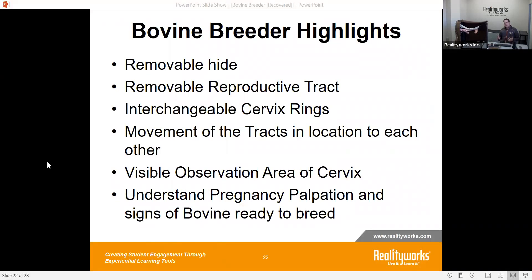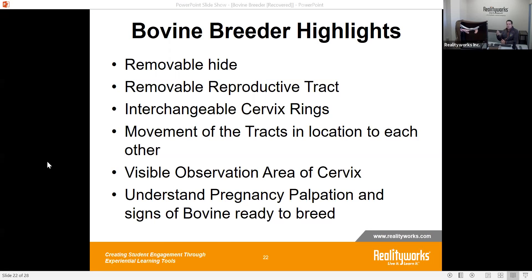Talking to Willie about the features the bovine breeder can provide for instructors: it gives you a removable hide and removable reproductive tract, the ability to take it out, let students work through and see the different parts of the tract, understand all the pieces of the reproductive tract, how artificial insemination works, how you palpate to determine readiness to inseminate, and what pregnancy palpation involves.